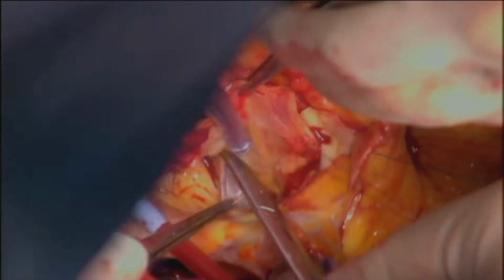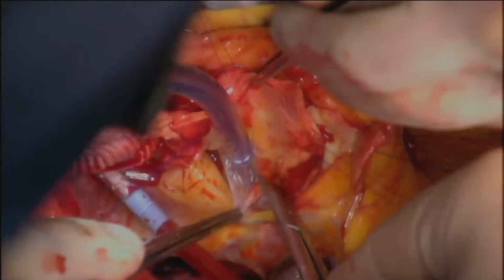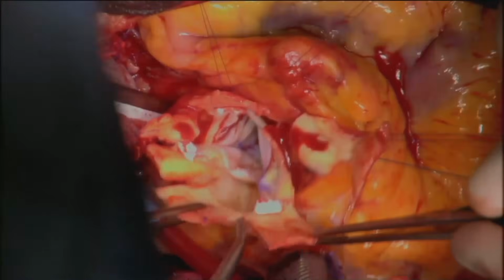Dissection was performed around the aortic root to make sure that we had gone down below the nadir of each cusp.